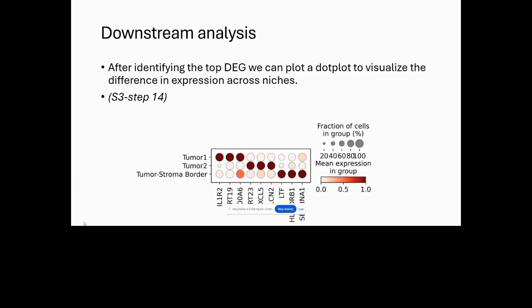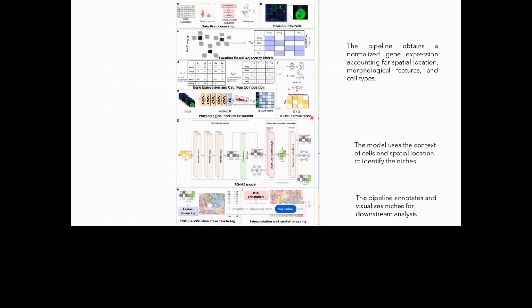So at the end, we just have the entire pipeline together, so you can just take a look at it.